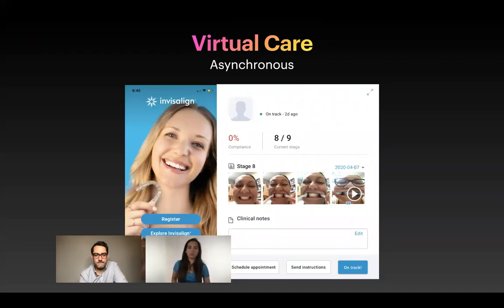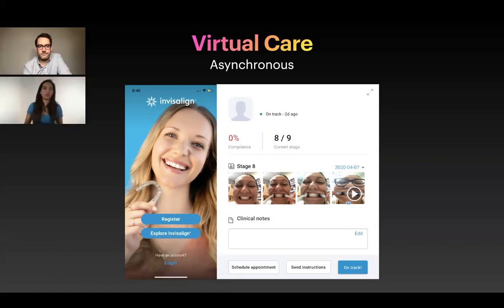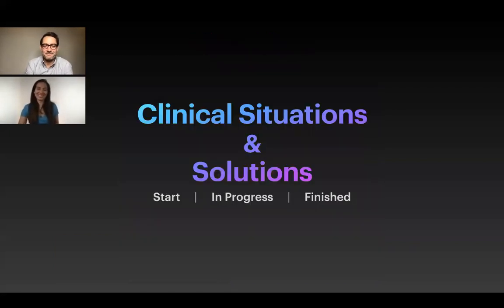And then you get to reply, you're on track, let's schedule a small consult appointment, or you can send specific instructions if you want them to use them for longer, if you want them to munch more on one side, or whatever you want to say. So I think it can save time, not only now, but for the future too, how to manage future Invisalign cases. Yeah, and you can do this stuff when your kids are sleeping. It doesn't have to be business hours. Important one for us. Totally.